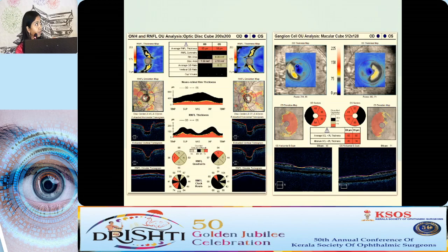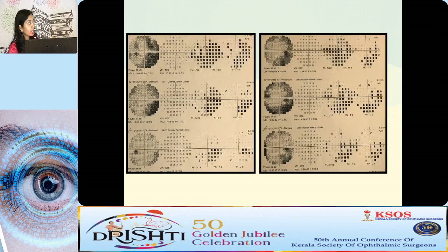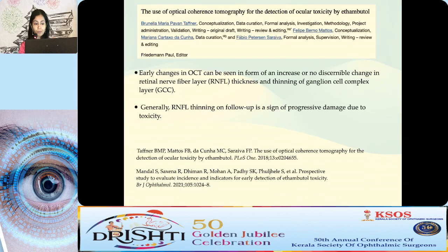On the other hand, if you look at this picture, there is a marked thinning of the RNFL and GCC here. If you look at this type of loss, it's a binasal kind of ganglion cell loss, which occurs very typically in sellar tumors. That's because these are the nasal fibers which are actually crossing at the chiasm. So this was a visual field defect, bitemporal hemianopia. And after surgery, this is 6 months post-surgery, the visual field didn't improve completely. It did improve, but it didn't improve completely.